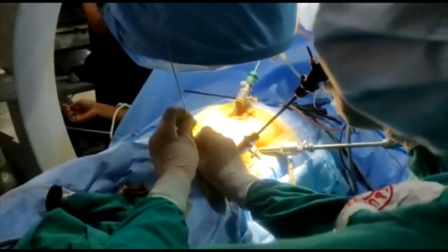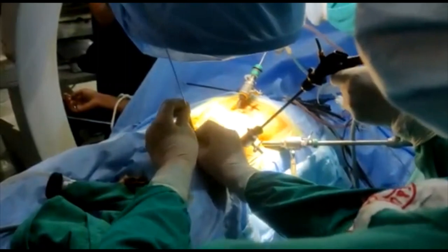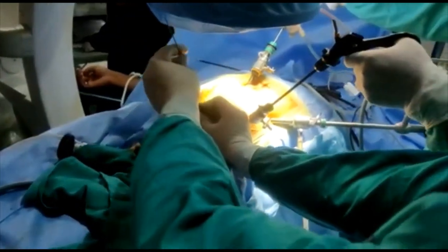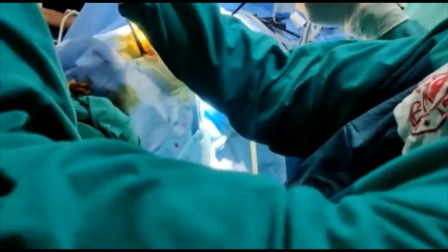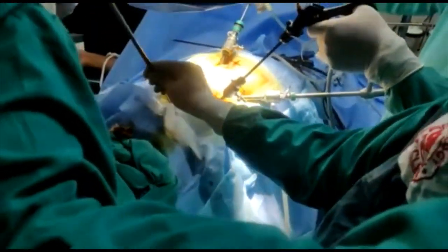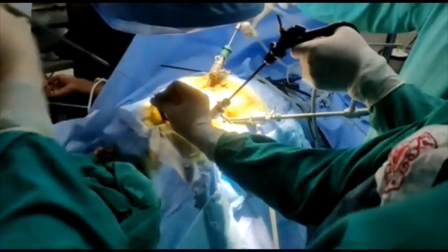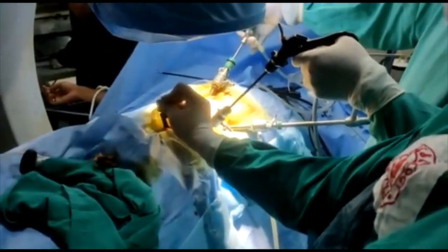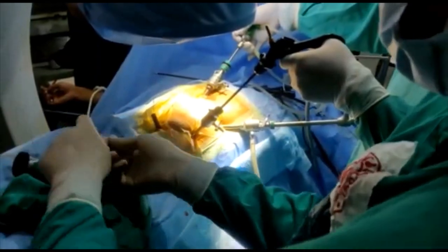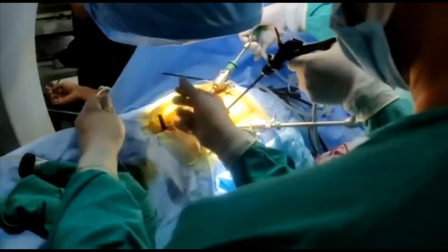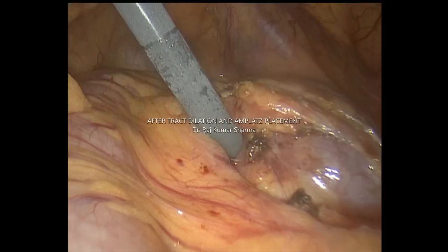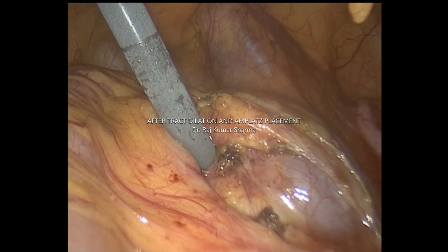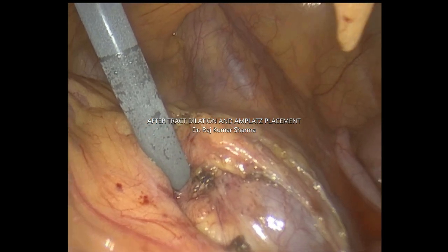An Amplatz sheath of 22 French is being used in this case. Both fluoroscopy as well as laparoscopic guidance is very important in this type of case. This is the picture after placing the M-plus sheath.